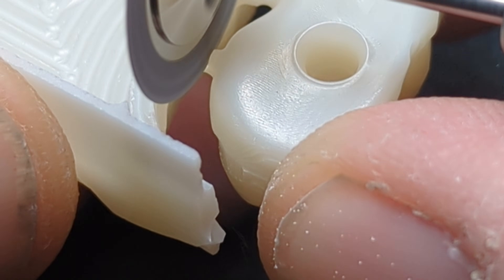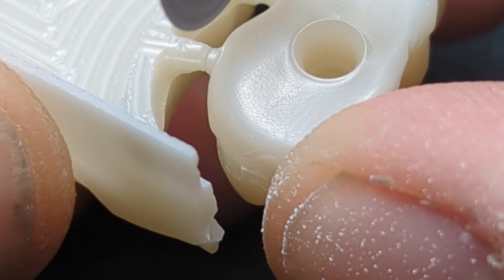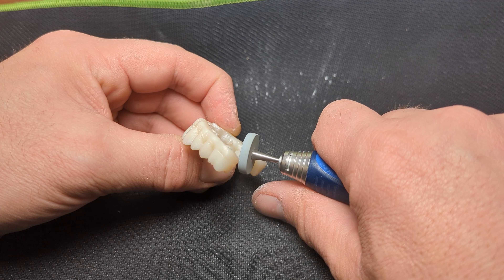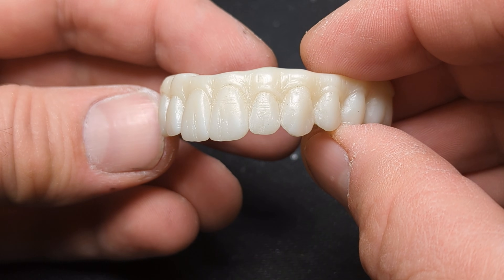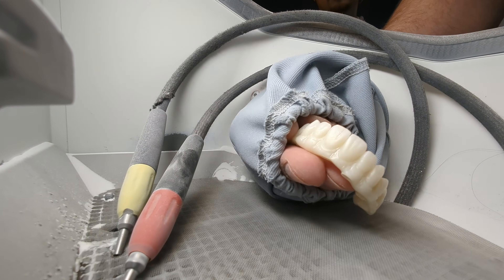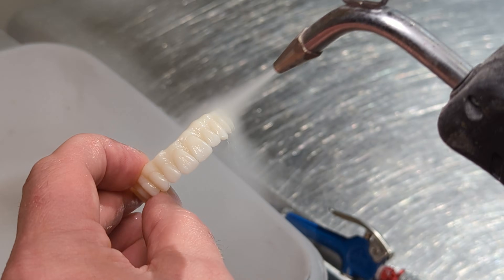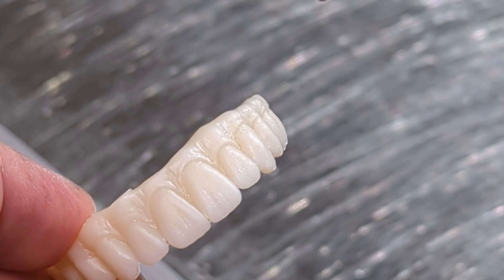After the zirconia is fully sintered, I carefully remove the support bar and grind off the support pins. If I did my job correctly in green state, that is all I have to do in contouring. The zirconia has a thin oxide layer on its surface, so I recommend sandblasting the surface with aluminum oxide at low pressure. Before glazing, clean the surface in an ultrasonic bath and steam cleaner to ensure the zirconia is free from dust and oil, prepared for the exciting next steps of glazing with Mio.